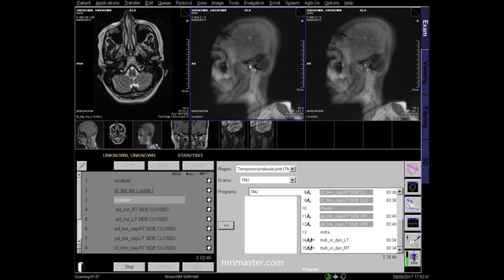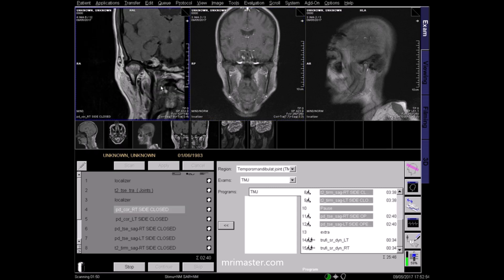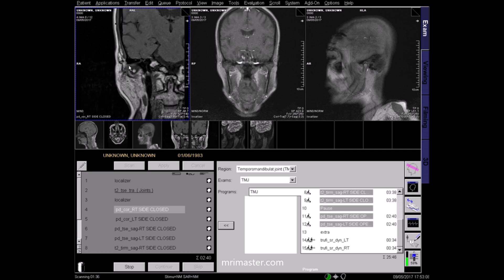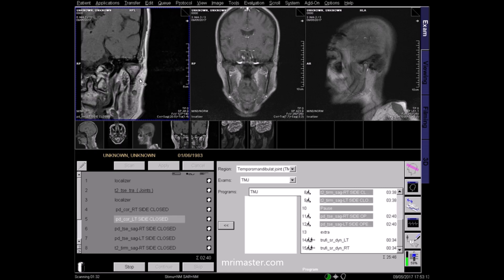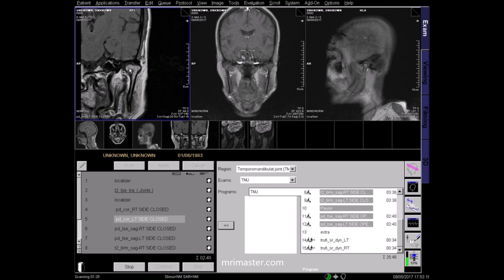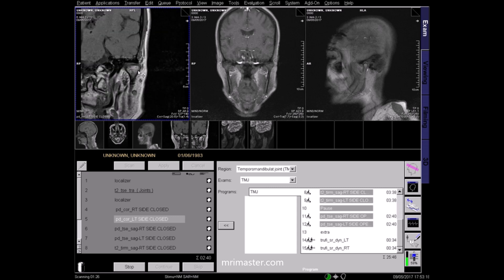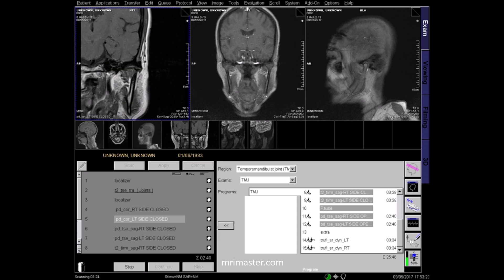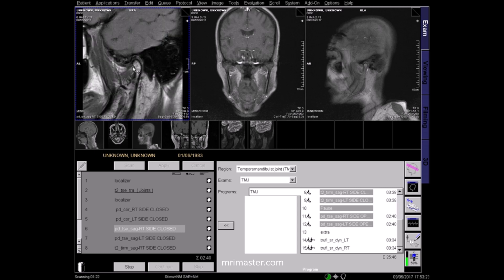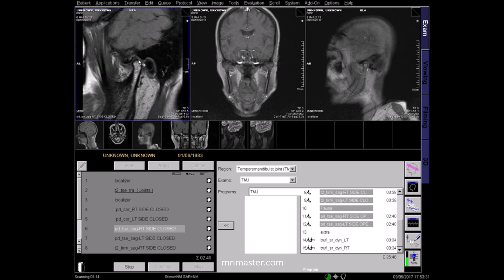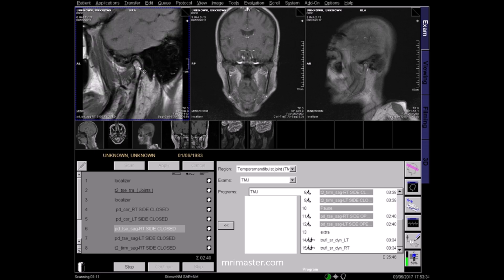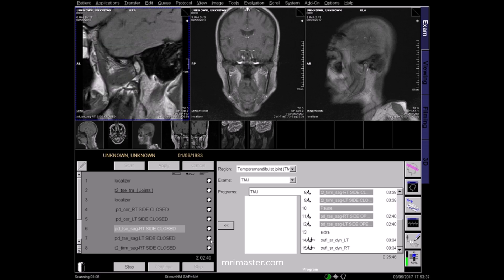On this sagittal localiser, here is the TMJ joint. And here they are on the coronal localiser. This is the right TMJ joint. And here is the left TMJ. It is composed of the mandibular condyle within the articular surface of the temporal bone, in between which lies an articular disc. This is the right sagittal PD image, where you can again see clearly the articulation of the joint and the angle of the ramus leading into the body of the mandible. PD images are very useful in visualising ligaments and cartilage.